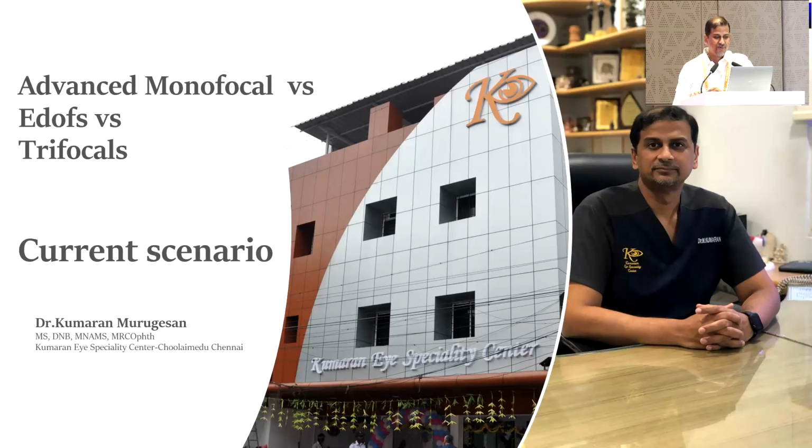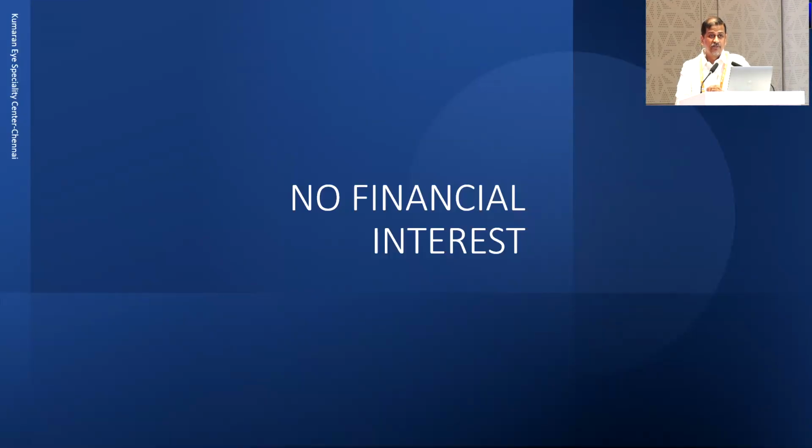Thank you. So my talk is going to be on advanced monofocals, EDOFs and trifocals. The odd man out here is the advanced monofocal because it really doesn't fit into the category of presbyopic lenses. But because these advanced monofocals have been doing very well and giving comfort to the patients, they have broken the shackles and come to be compared with EDOFs and trifocals, which are categorized as the presbyopia-correcting lenses.